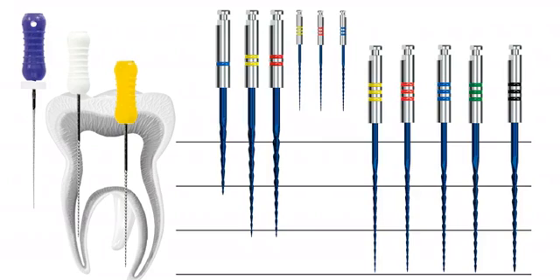Well, there are some simple cases. This is a simple case. This is a recently cemented zirconium crown, and the patient developed irreversible pulpitis. It was a wide canal, so I opened it. I got an entrance through the crown with a bur. It was just one canal. I'm talking about the second premolar.